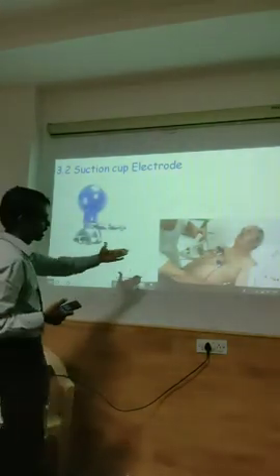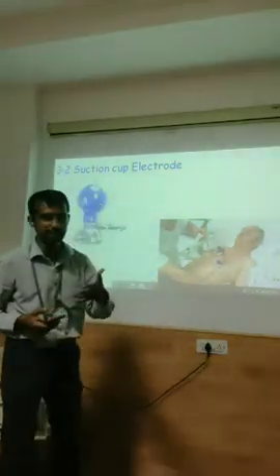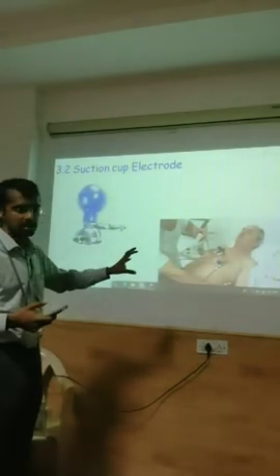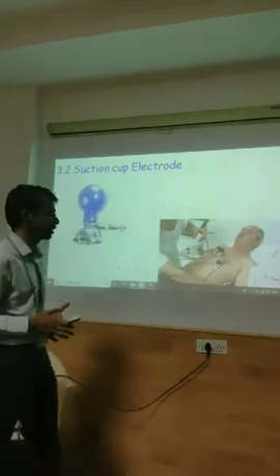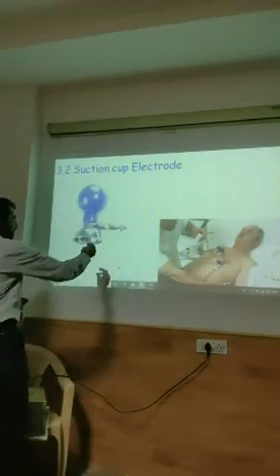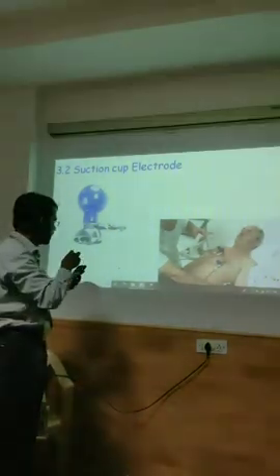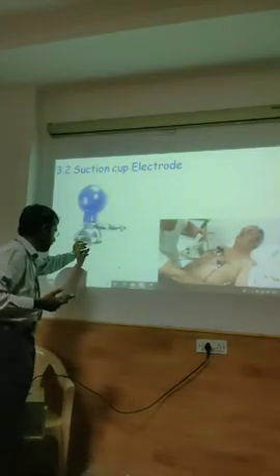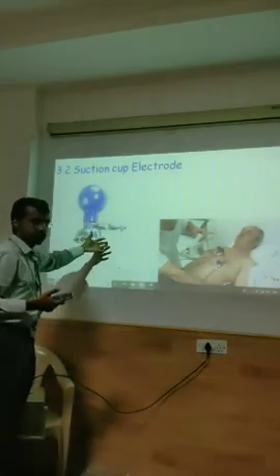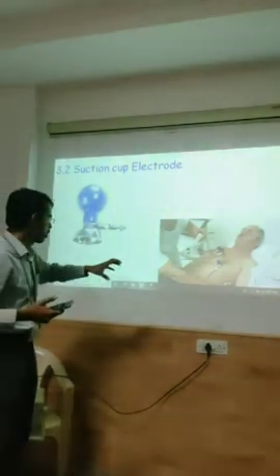So this is used in places like ECG measurements, electrocardiogram. We take it to study the activity of the heart, or breathing, meaning lung breathing capacity, and all those studies will try to use it. So this is how the patient is taken to measure. We have a knob, so when we tighten it, the suction becomes very strong and the signal which is read will be proper. More accuracy depends upon more sucking or more attachment.